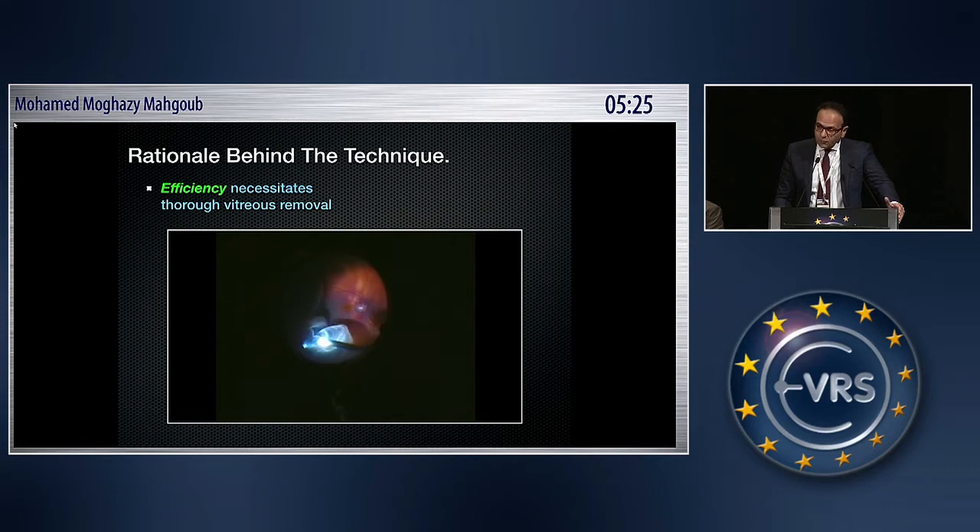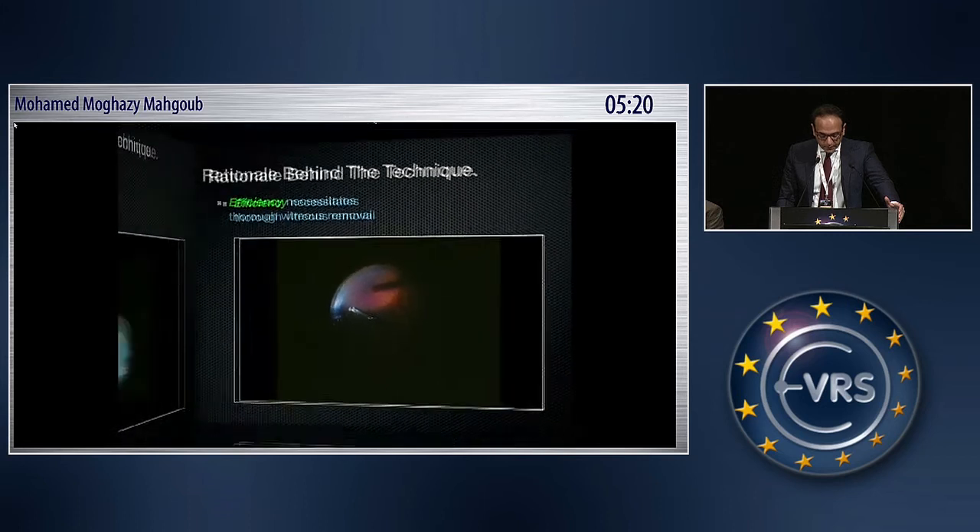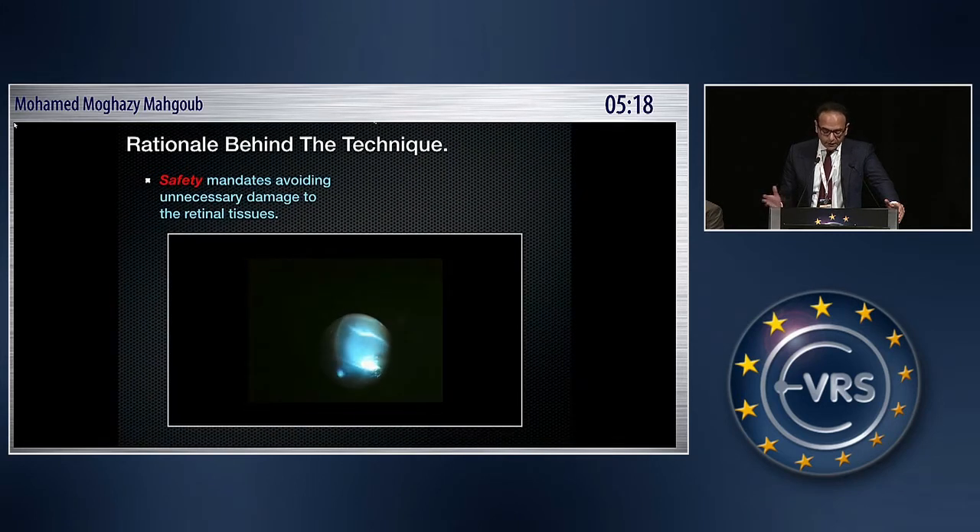Thorough vitreous removal is not always possible in the presence of high retinal detachment. Safety also mandates avoiding unnecessary damage to the retinal tissue, and again, in cases of high retinal detachment, this cannot be achieved thoroughly.